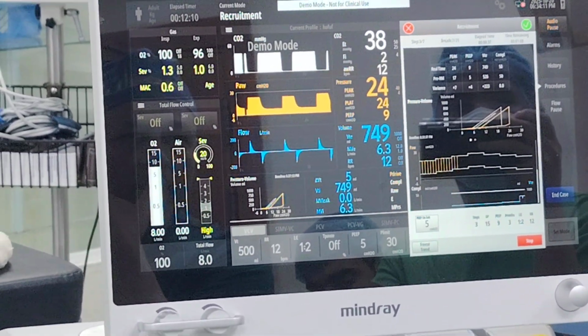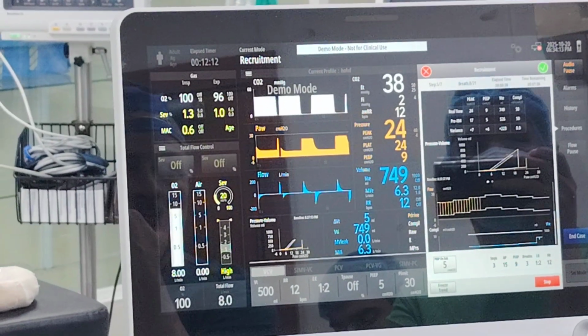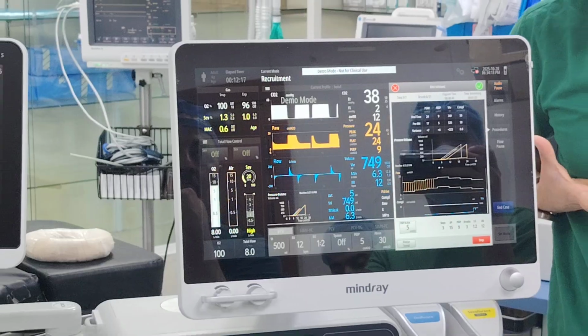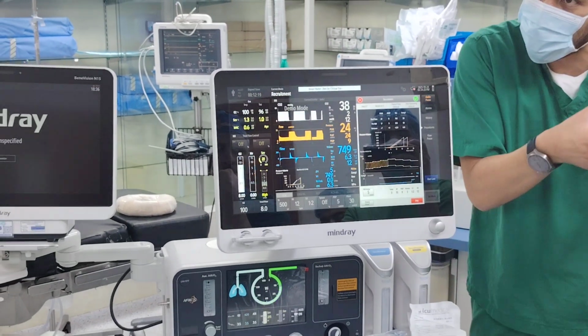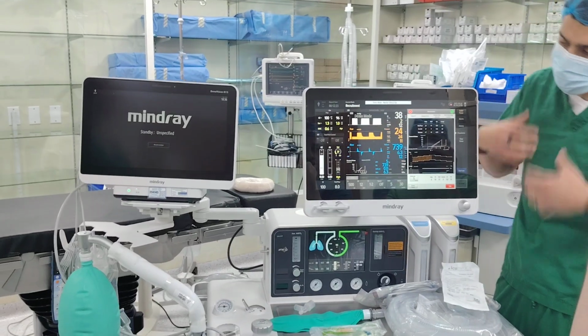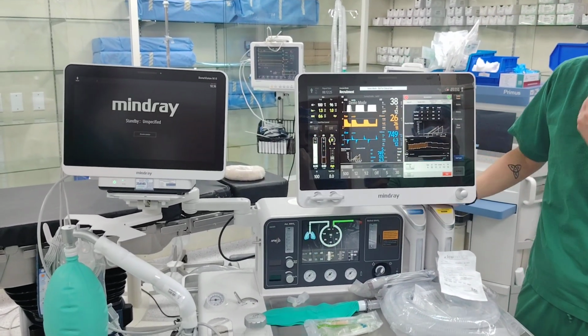And then some doctors, because I was successful, will say I will put PEEP plus 2, meaning my baseline PEEP is 7, to keep it open. The problem is how you can open it. Can I open it, yes or no? Can I keep it open? This is another question. So some doctors like to put an extra PEEP.